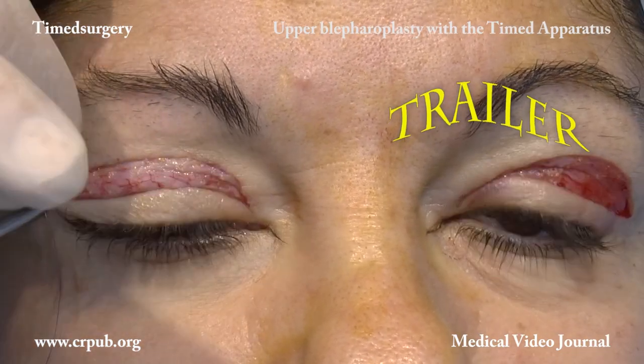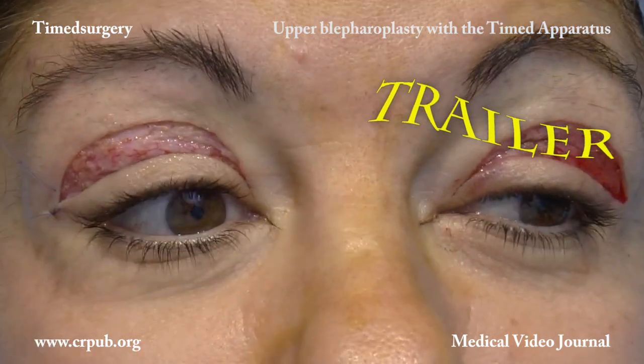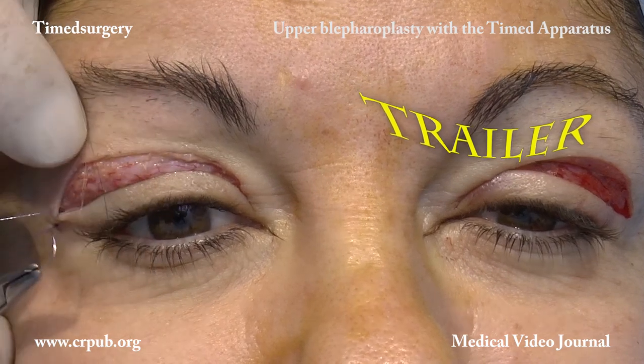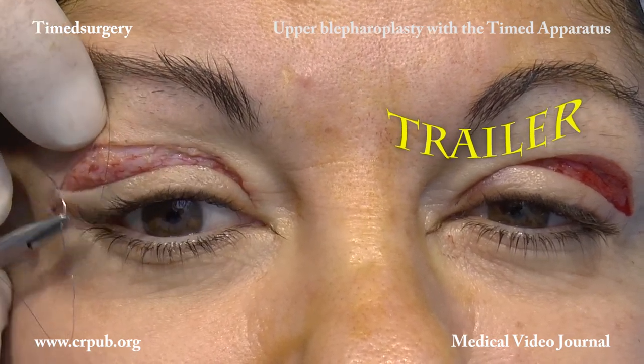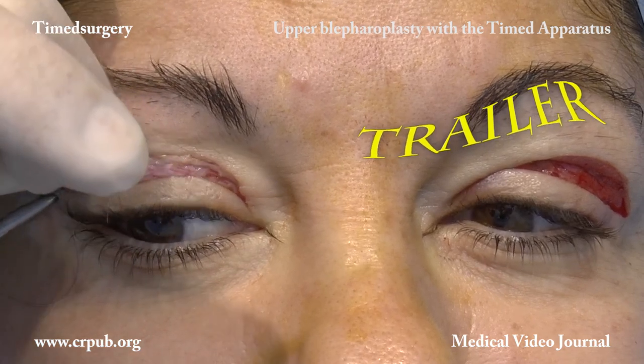The symmetry of the two eyelids is checked, considering that the orbits are often asymmetrical. Not only are the areas of skin excision compared, the residual areas of eyelid skin are also checked.